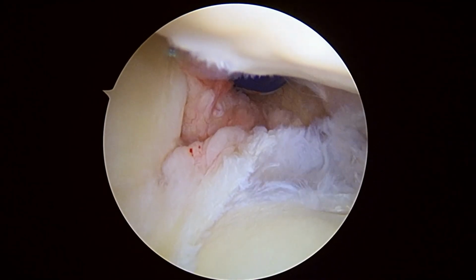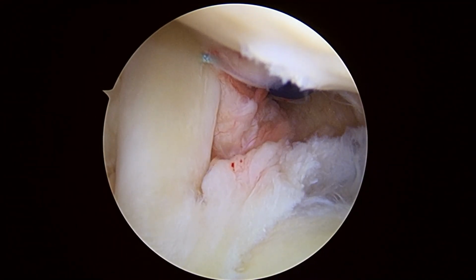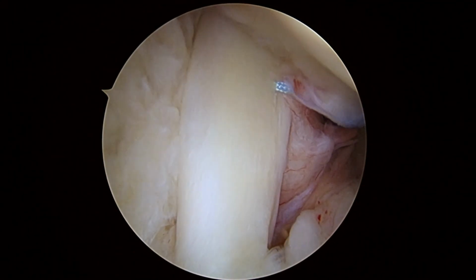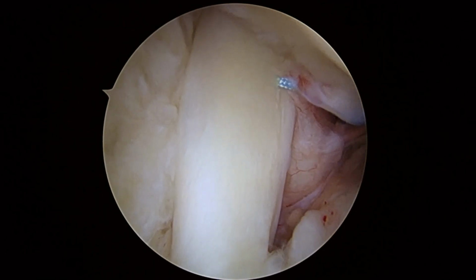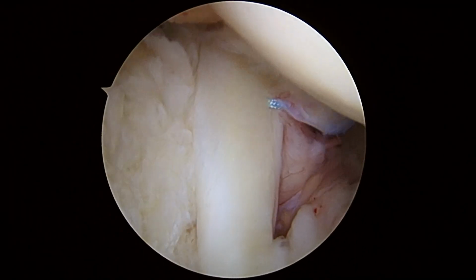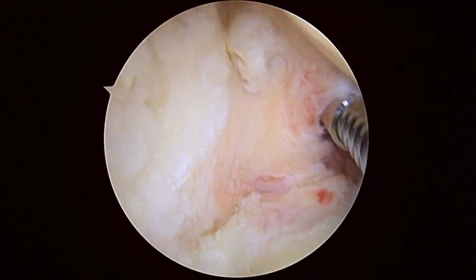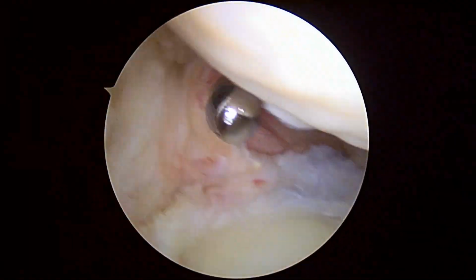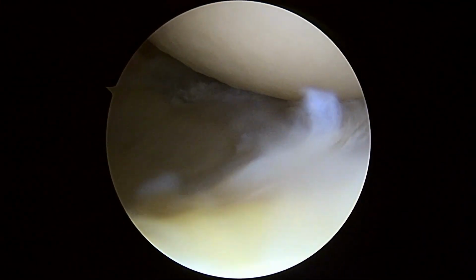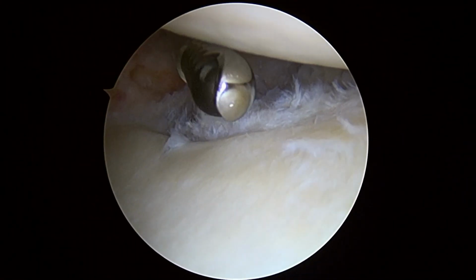And then we're going to do the same thing one more time. Just about there. We'll show you some more in a minute. Okay, so we've released the biceps. You can see the edge of it right there, and we can see the arthritis. You've got some bare areas on the humeral head, some arthritic changes on the glenoid, but nothing else to do surgically inside the joint. So we're going to clean up here a little bit more, and then we're going to get in the subacromial space.